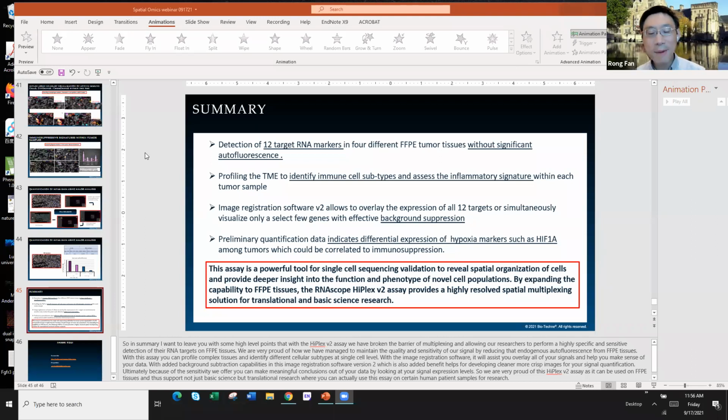Oh, okay. Yeah, my question is, in single cell RNA sequencing data, we never got like 90% sensitivity. Oftentimes we can detect only 20% or 25% of the transcripts, but the data is still very, very useful, very meaningful, largely because you can do normalization, you can even do batch correction.